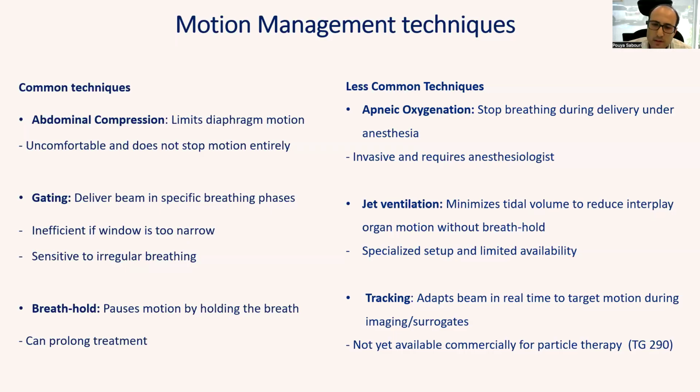sensitive to irregular breathing. Breath hold is one of the promising strategies among the techniques, and it attempts to completely pause the motion, and has shown success in reducing those delivery uncertainties, although it may extend the treatment time because the patient does need to go into multiple repeated breath holds.